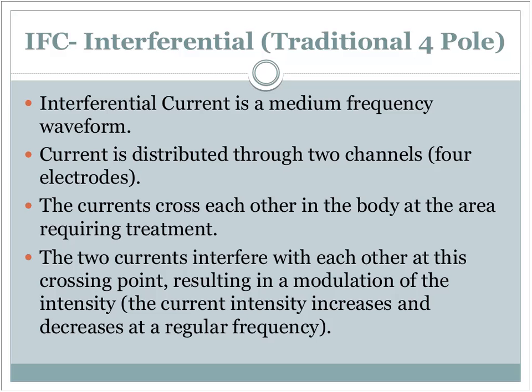So you've got these two carrier waves crossing in the center point and being slightly off, so that the wave that we're trying to use to create the electrical stimulation is created by this occasional doubling of the wave, sometimes canceling the wave. It's kind of really hard to explain, I suppose, and it may not be very clear, but just understand the fact that because it's being carried by this carrier wave and it's being delivered where those 2 points cross, it needs to go over the intended target, okay?